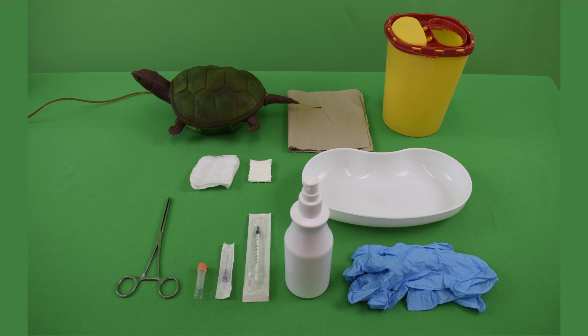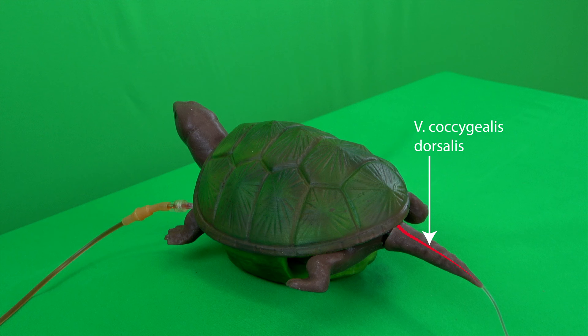Therefore, lymph can also be aspirated with the blood. The dorsal tail sinus, i.e. the dorsal tail vein, or vena coccygialis dorsalis, is the site of choice in turtles, which runs directly dorsal to the caudal spine.